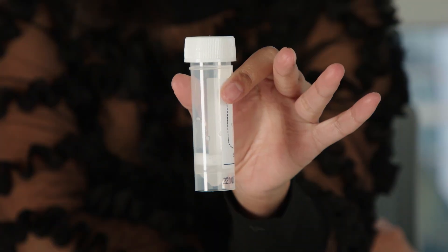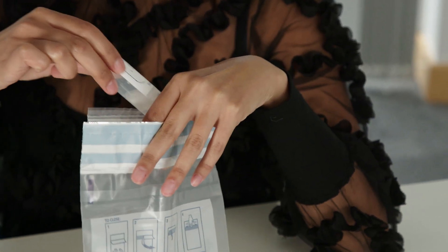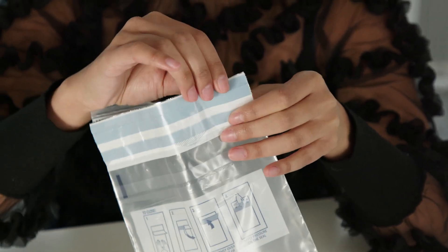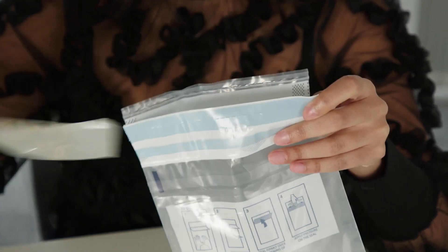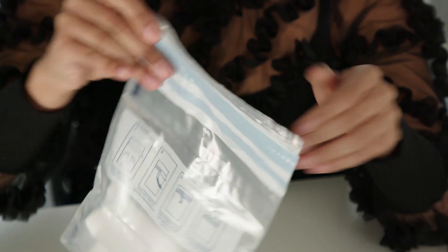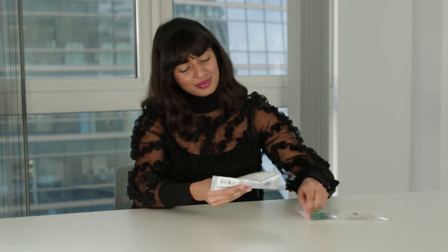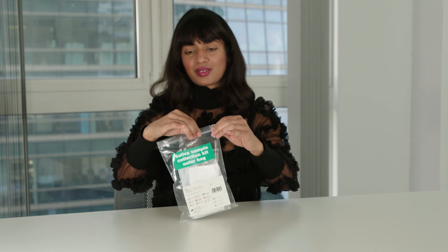Ensure there is enough saliva collected to reach the 2ml line on the collection tube. Open the leak-proof bag and place your tube into the bag alongside the absorbent pad. Do not touch the absorbent pad or remove it. Then seal the bag using the grip seal, ensuring it is airtight. Place the bag containing the tube in the polygrip bag and seal this as tightly as possible, pushing out the air before it is sealed.